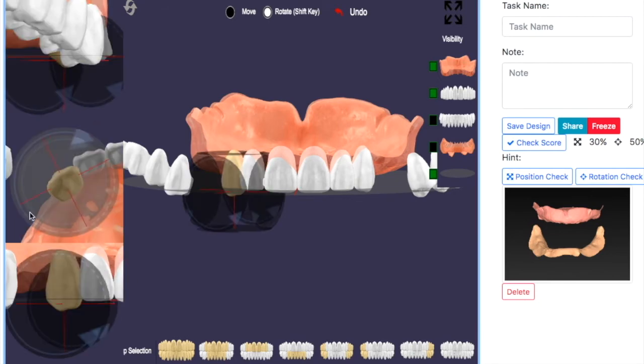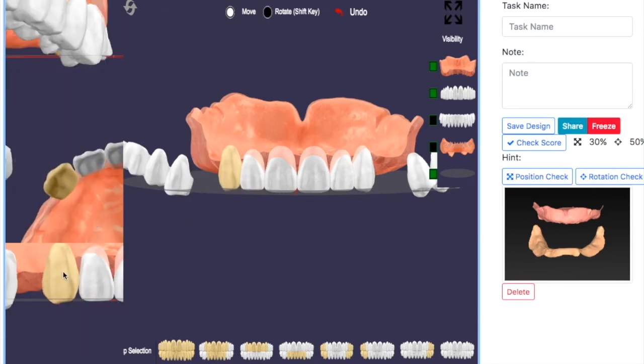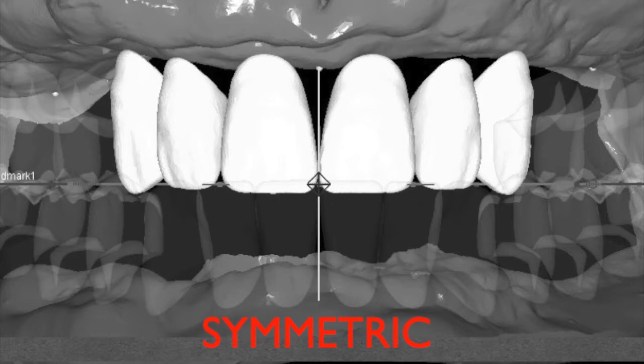Once you complete all the anterior teeth, symmetry should be achieved from teeth 6 to 11 before moving on to the next step.